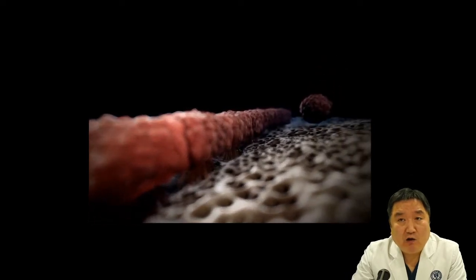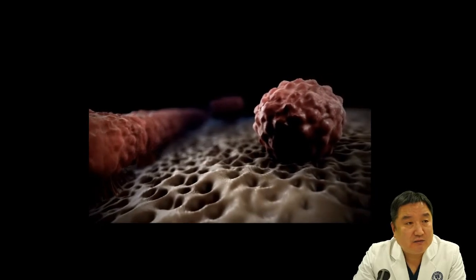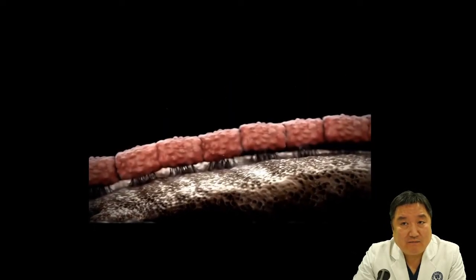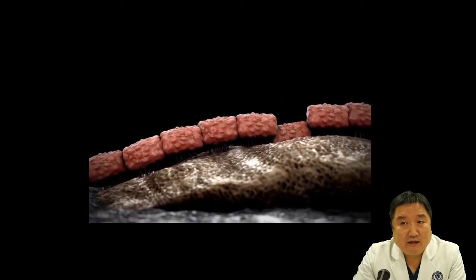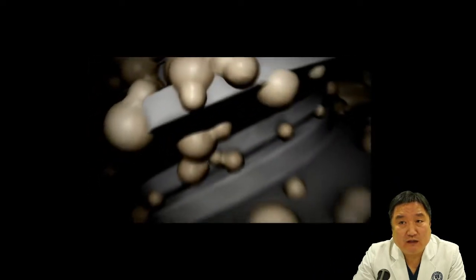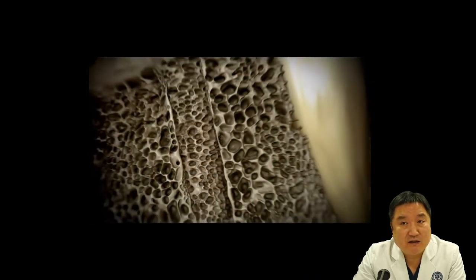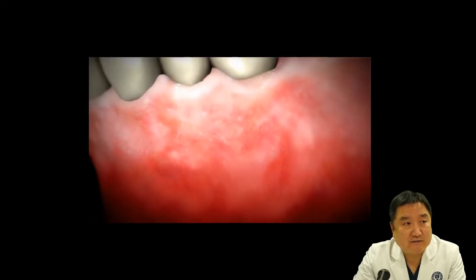Therefore, how many of these cells and proteins can successfully land, maintaining their activity, proliferation, and spreading, is very important for the osseointegration process. So favorable circumstances and characteristics of the titanium surface are very critical for osseointegration.